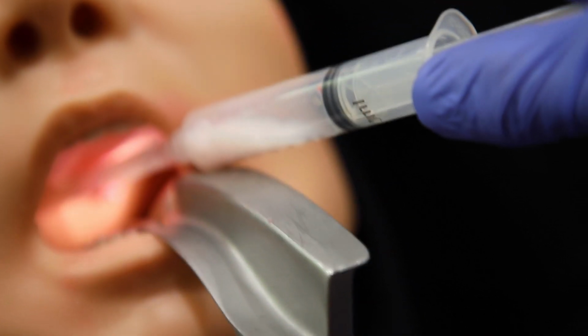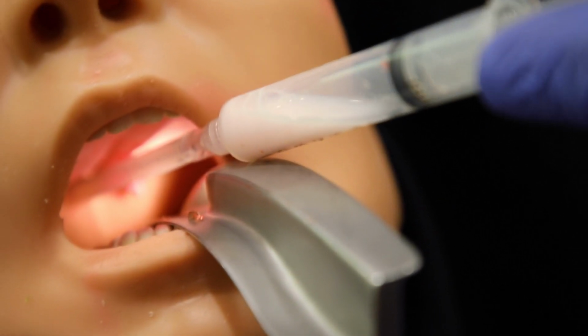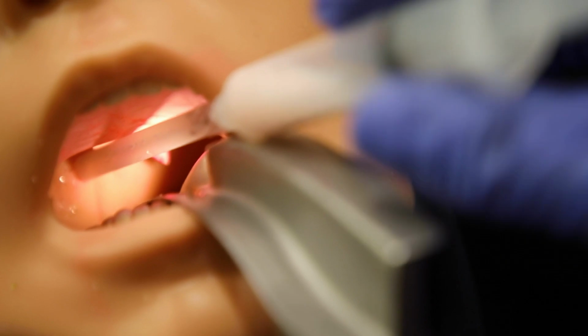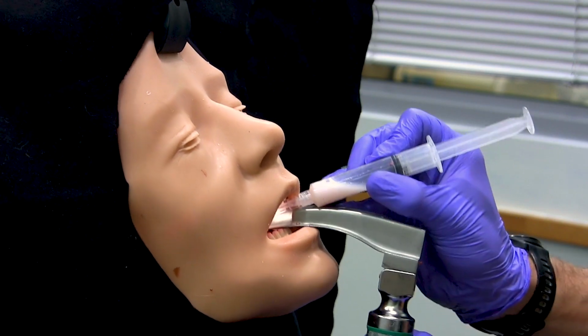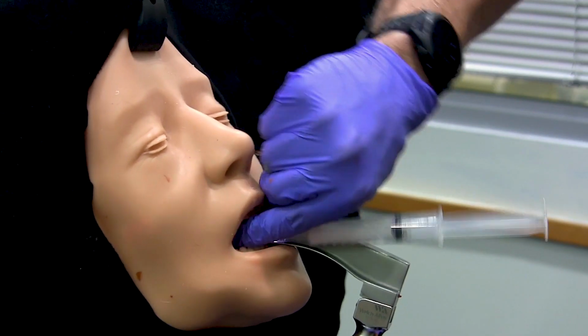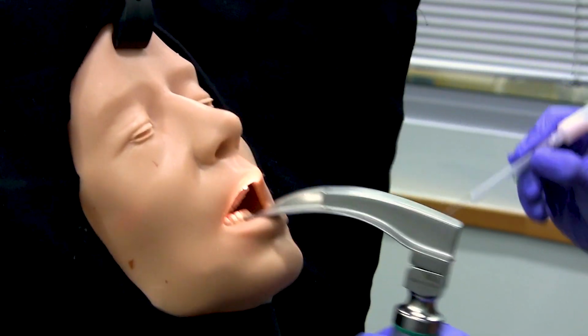So you can see here, I'm aspirating back, getting purulent drainage. So this would be a successful drainage. We'll go ahead and come out now at this point. And as we pull back, want that guard to come with it.